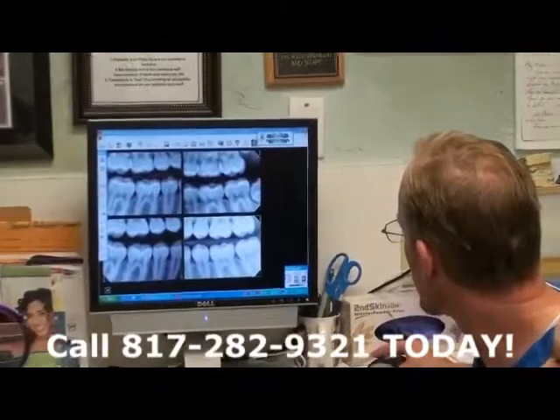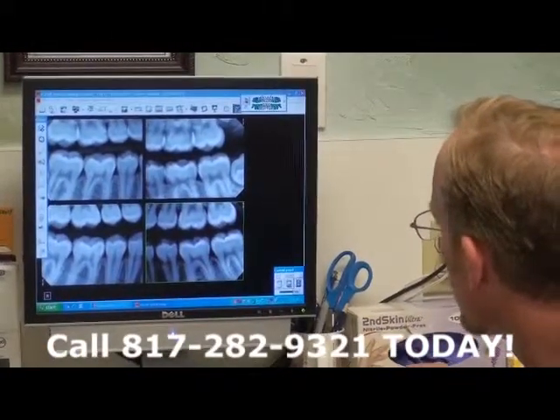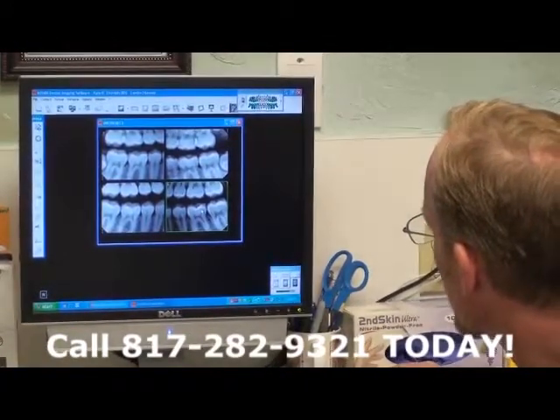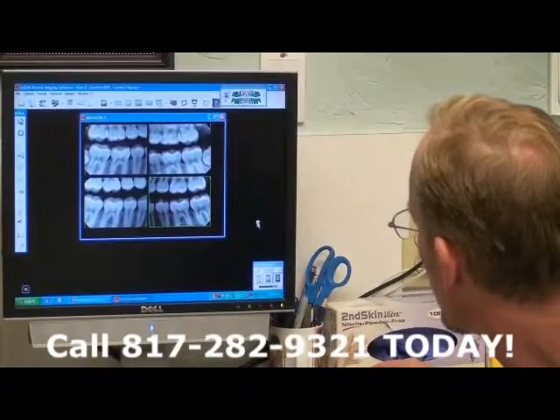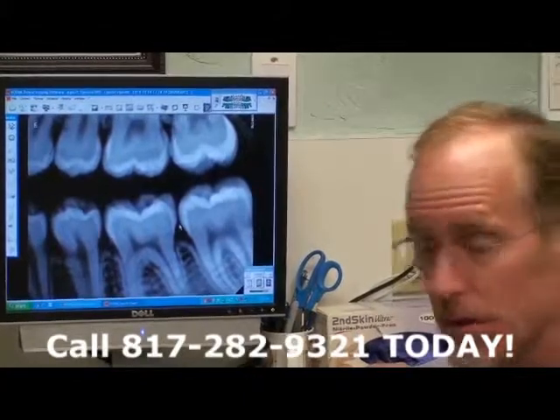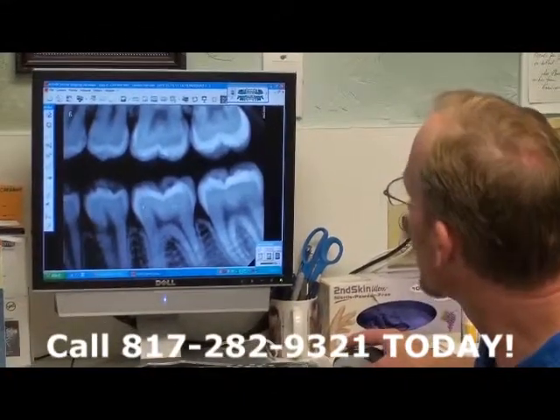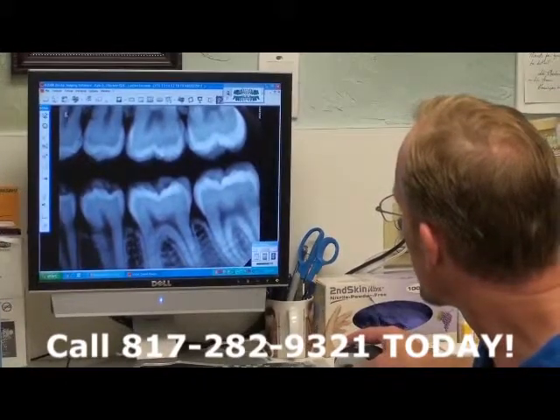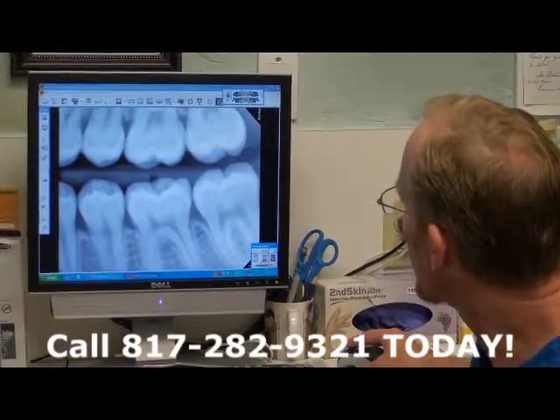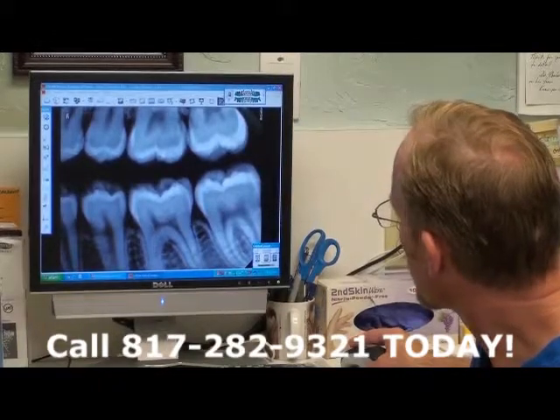So, for example, I can change that to be darker or lighter, or if I need to look at it closer, I can make the image much larger and blow it up to that size. By enhancing the image, it allows me to look for areas on her teeth where she may have some cavities. In this particular x-ray, we can go much darker, but sometimes that's not better.